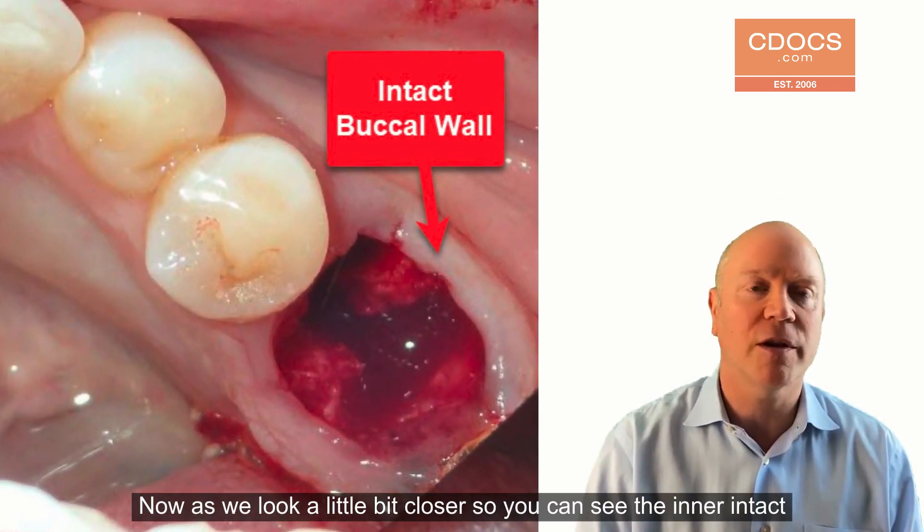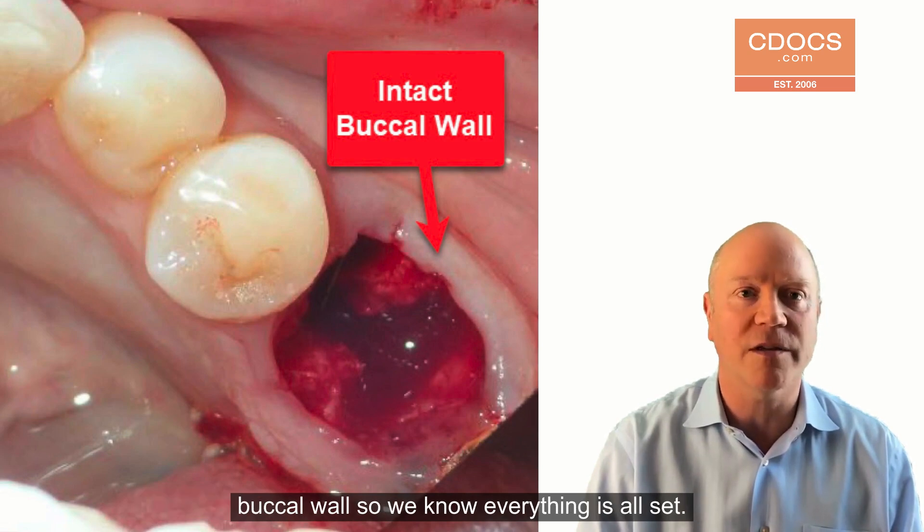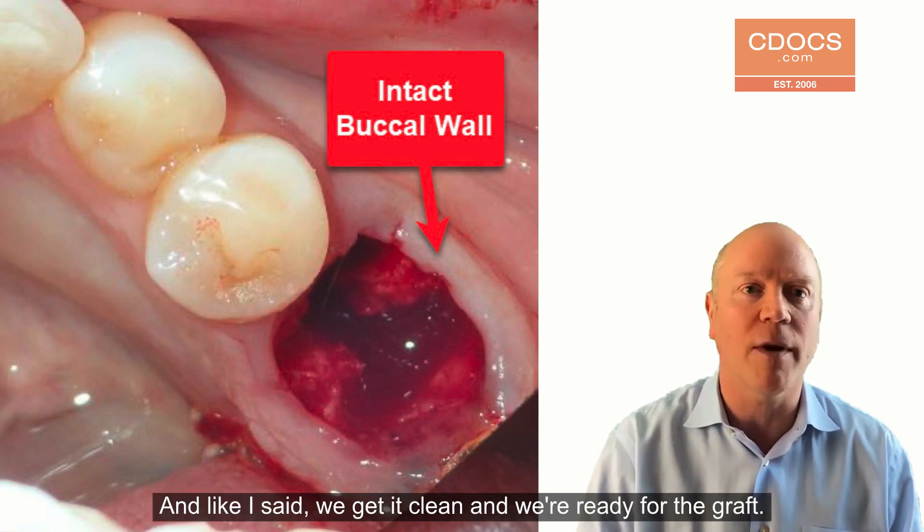As we look a little bit closer, you can see the intact buccal wall, so we know everything's all set. Like I said, we get it clean and we're ready for the graft.